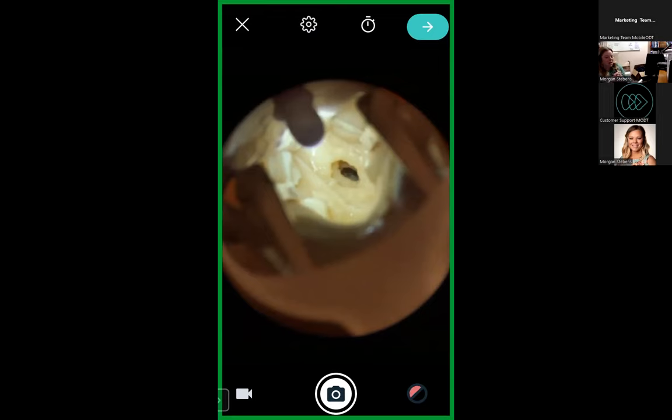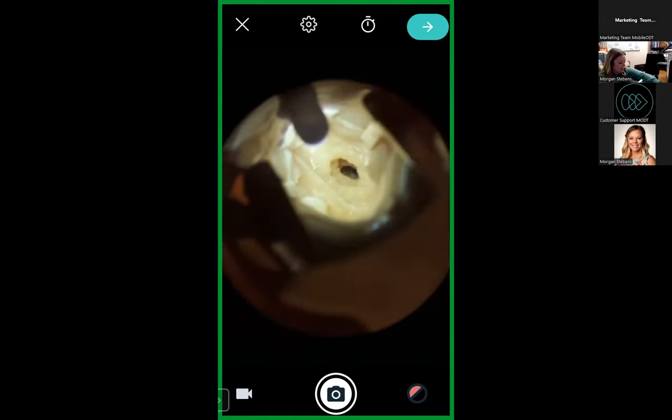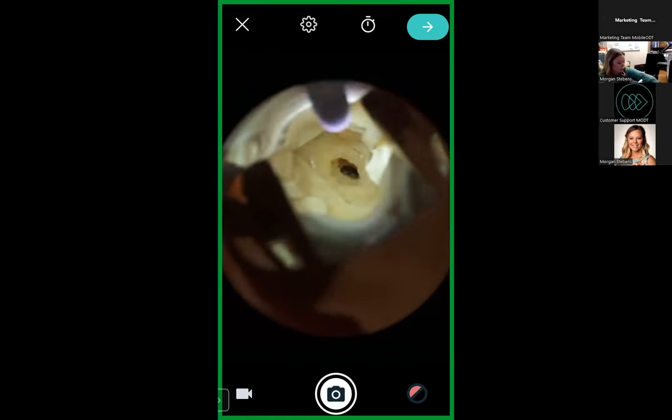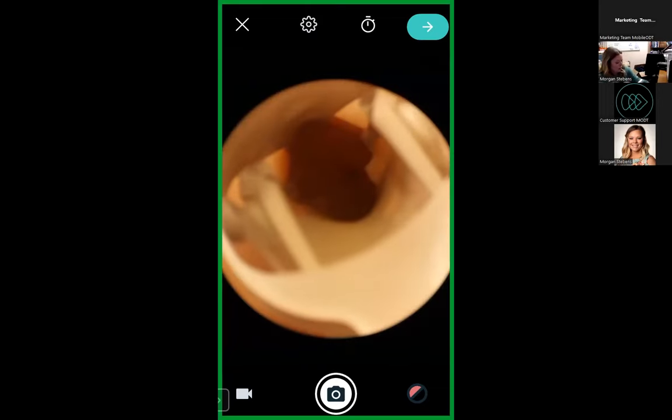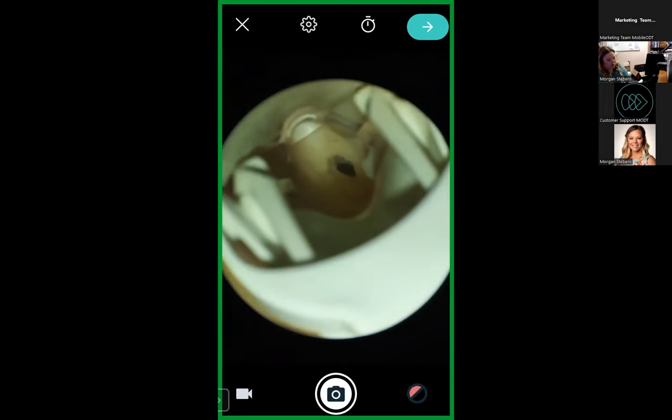So this is why we use the colposcope, because it really gives you a good visual of that vaginal vault. It's a tunnel, right? It's hard to take photos of. And so this magnifies it, but it also gives you a really clear photo. This piece right here is a light that comes with our speculum that we utilize. I'm going to remove that light and let you see what it looks like to use the light that comes on the colposcope.